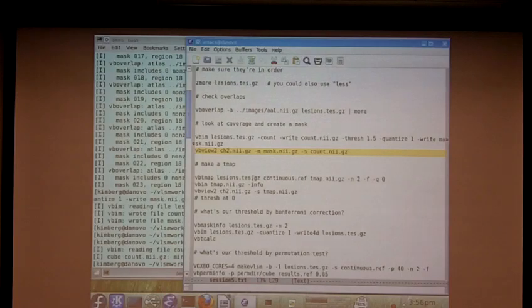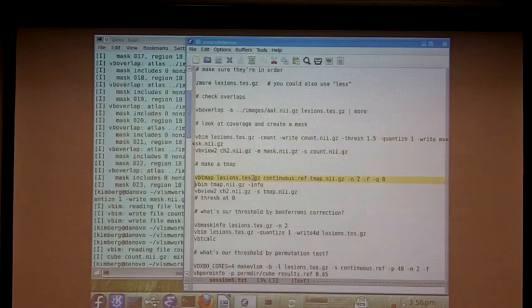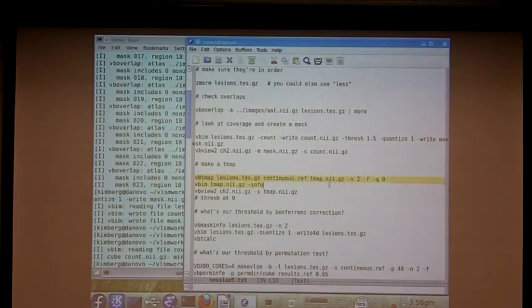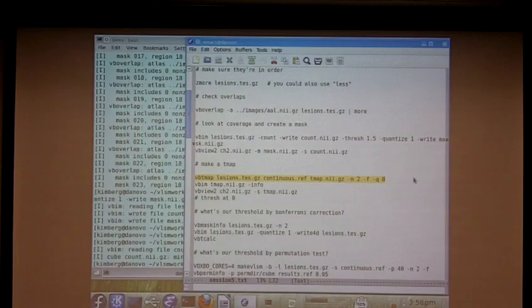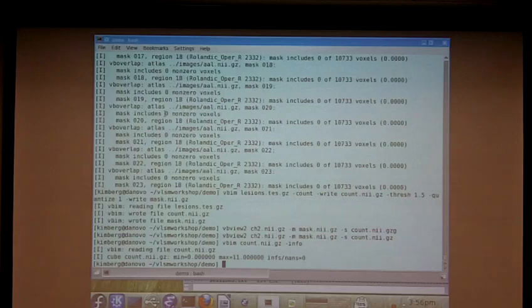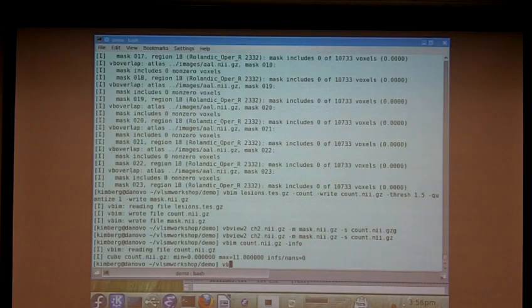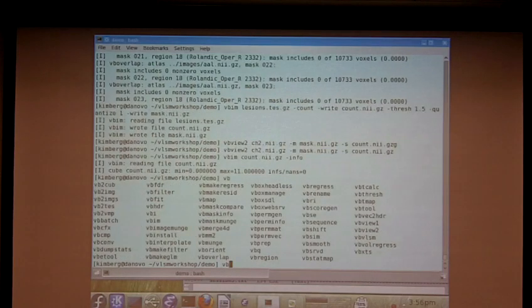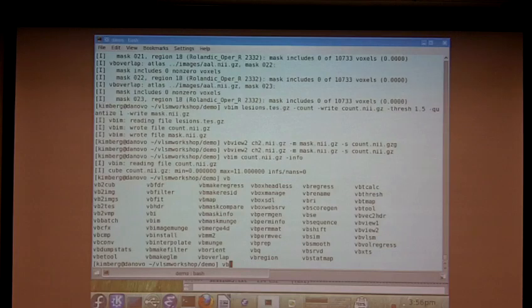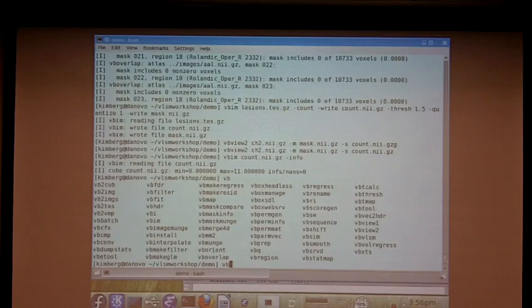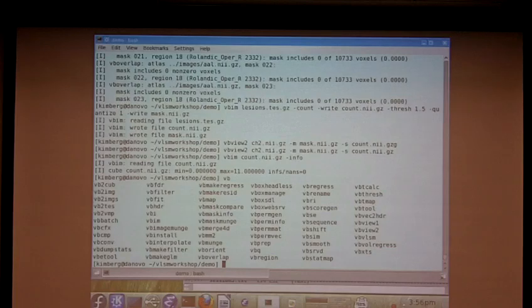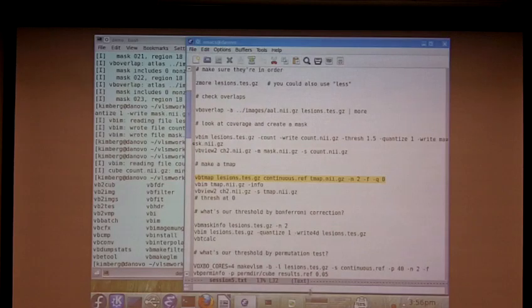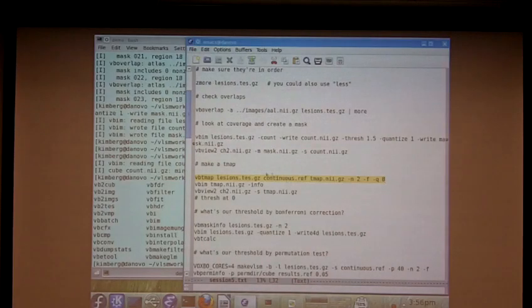So I told you there was going to be a big payoff and this is kind of it right now. After this, you can all go home happy. The command to create a T map in Voxbo is called VBT map. I should mention, by the way, many Voxbo commands are called VB something. Some aren't, but most of them are. And the reason for this is so that you can take advantage of tab completion in Linux in the bash shell by typing VB and then hit tab a couple of times and you'll get a list of Voxbo commands. So that's sometimes helpful if you forget what something's called, which I often do.